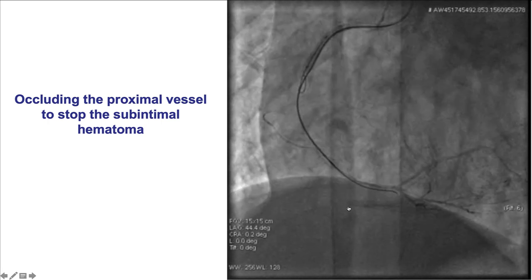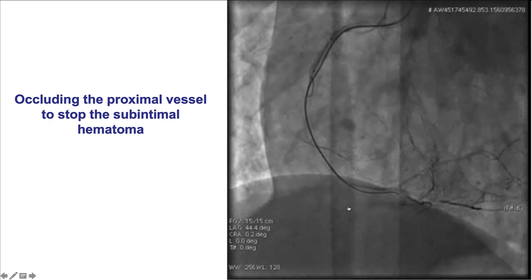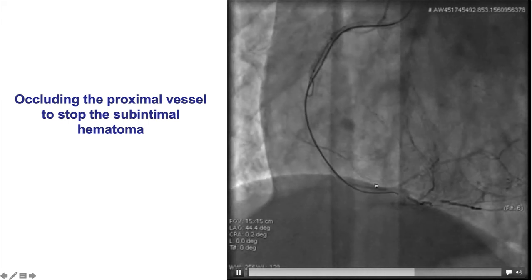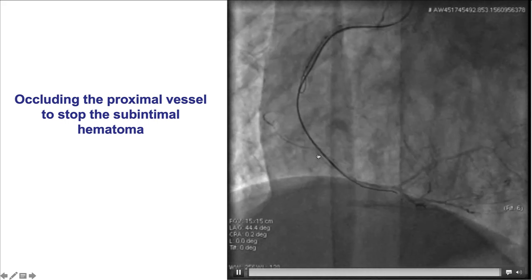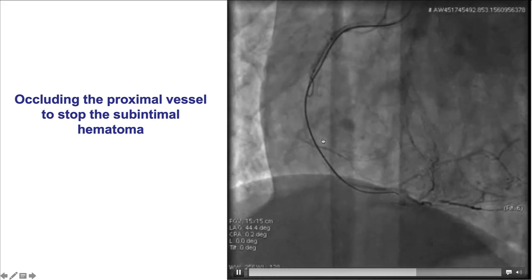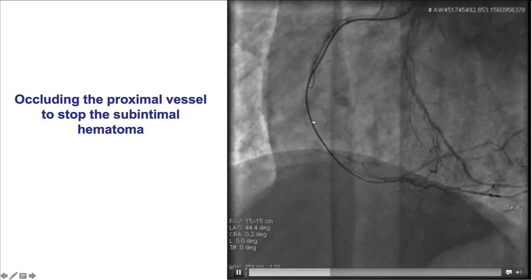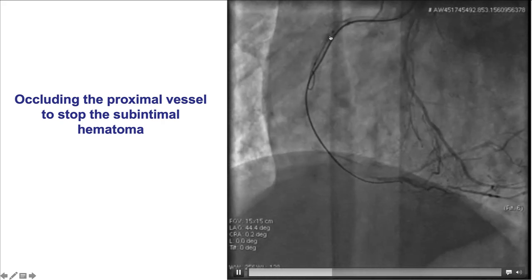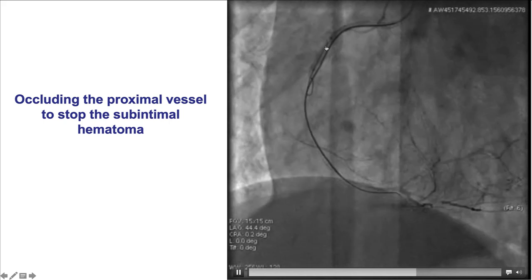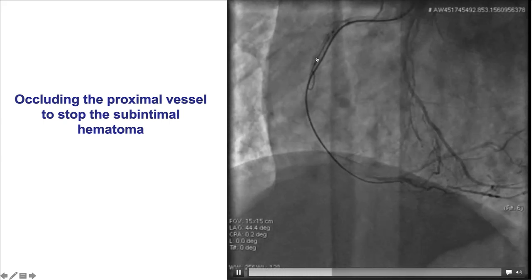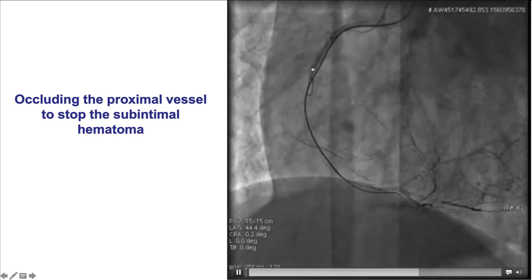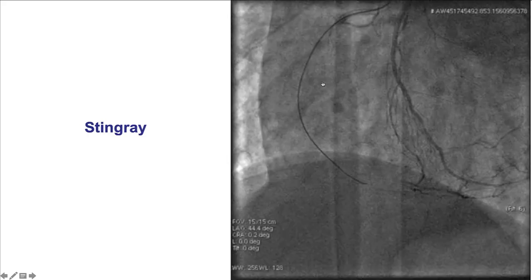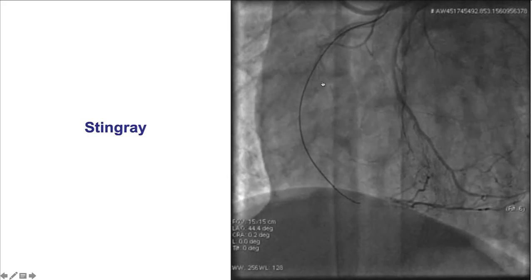One of the complications of ADR that can make things difficult is hematoma formation in the sub-intimal space. We can already see that there is distal vessel compression likely from sub-intimal hematoma. Very astutely, a balloon was placed more proximally and inflated to prevent expansion of the hematoma. Another option is to use a guide extension, as was done later.